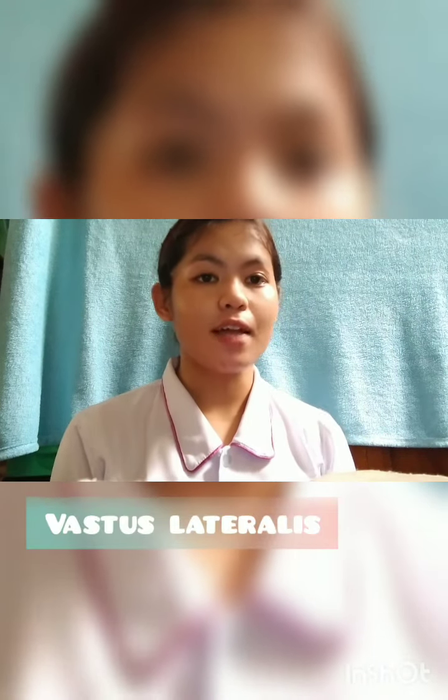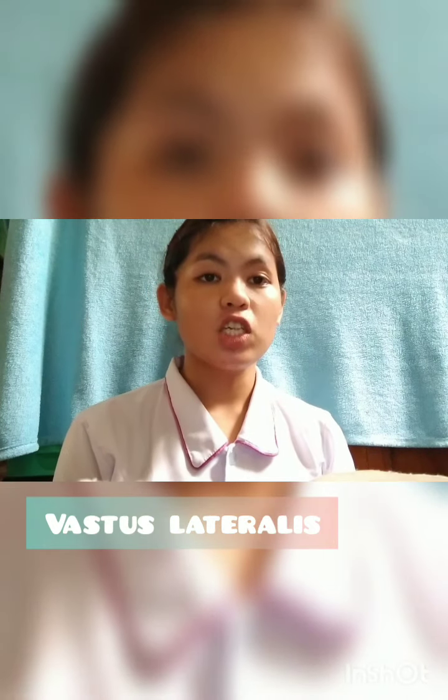Let me demonstrate first how to administer medication such as vitamin K and Hep B vaccine for infants, and the site is vastus lateralis. Since our patient is an infant, all the assessments would be conducted through interviewing the caregiver or the mother of the infant, and we also have to observe the infant.